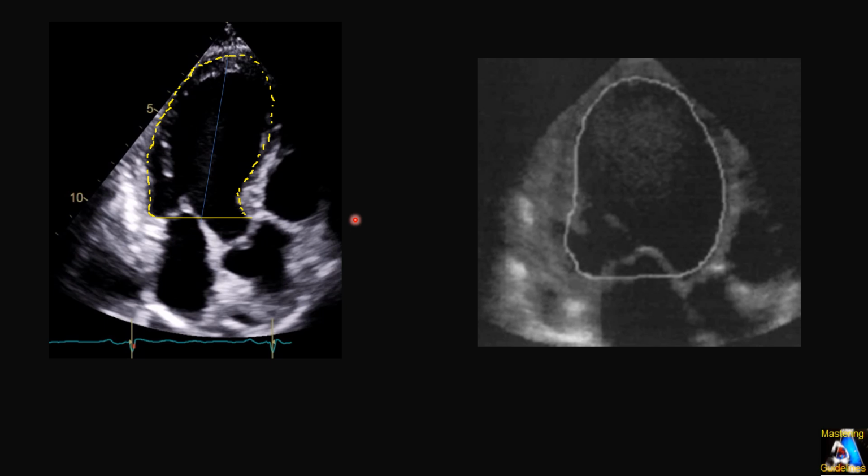And don't forget again, when you do any measurement, always correspond with the other findings and your eyeball guessing. Remember I had 3 clips about that. So corresponding your finding with that is very helpful. You know, okay, is that right or not? At least you go and fix the mistake.